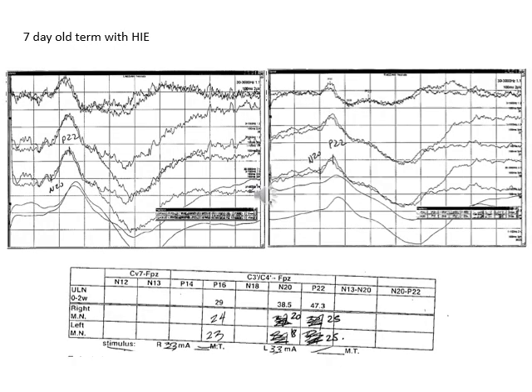This is another recording of an SEP in a 7-day-old term baby with HIE, just to show you how different they can look. And so this one, the peaks are actually very well formed. And so the most prominent positivity is the P22, and then the negativity seen just before the positivity is identified as the N20. And so this is a normal study bilaterally.